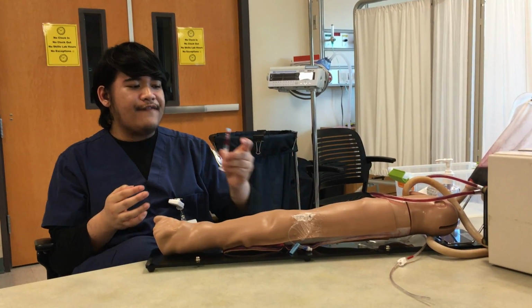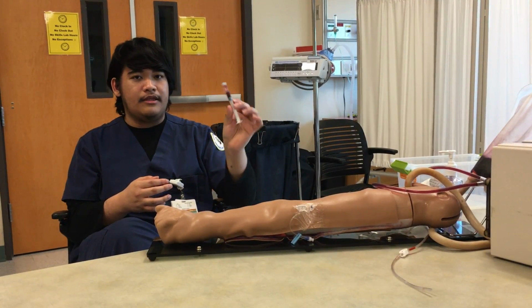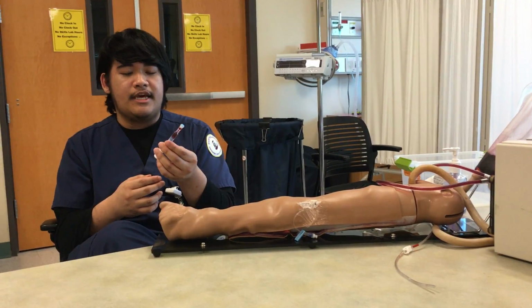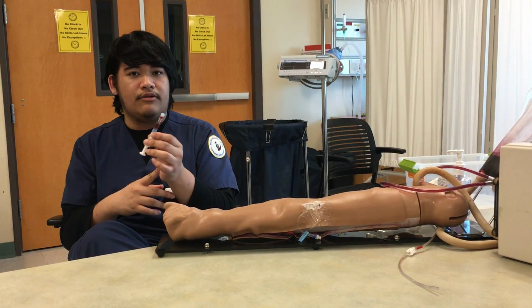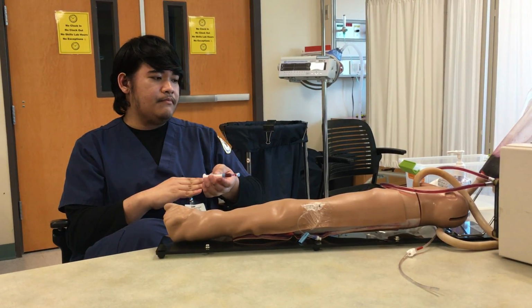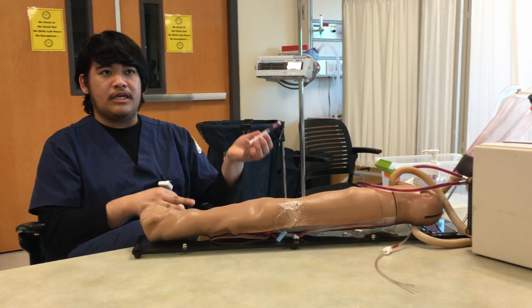If we have an excess of heparin in the blood sample, it could increase the pH and decrease the CO2, which is not good for this test, and it could be a bit more diluted.